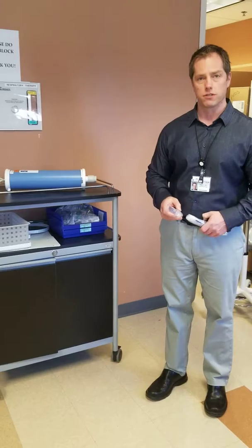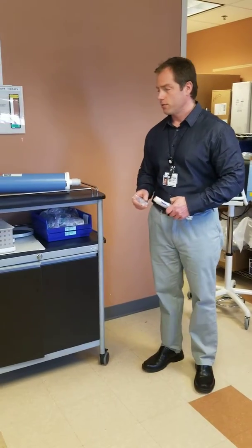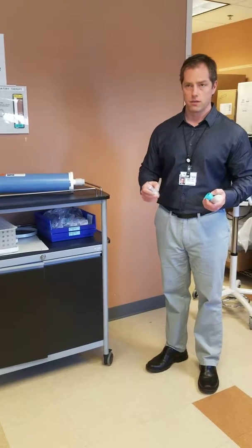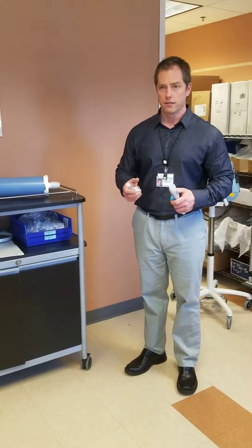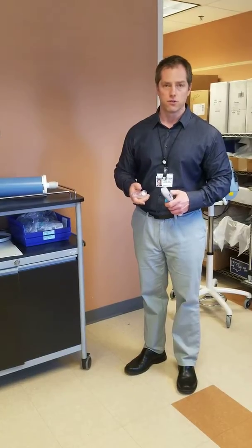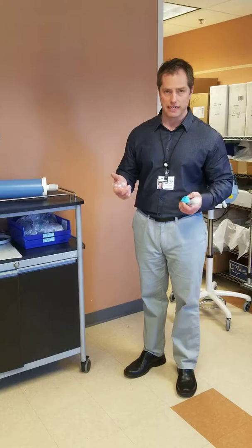I'm going to do a quick demonstration of the disposable spirometer kit from Salter Labs that we'll use here to measure patient's vital capacities — when our current spirometer is in use, is missing, or perhaps the patient is in isolation.